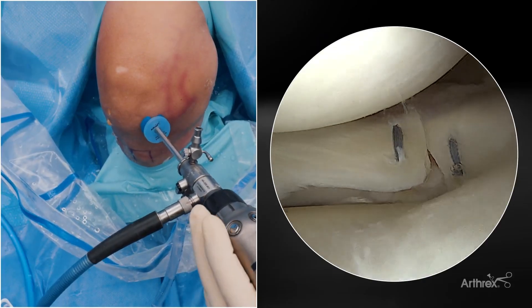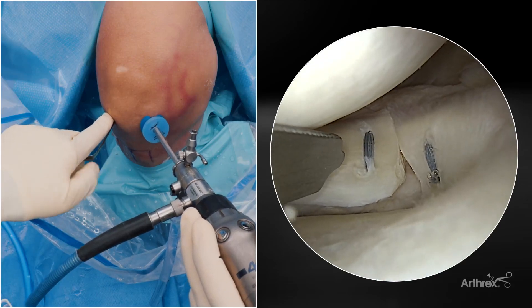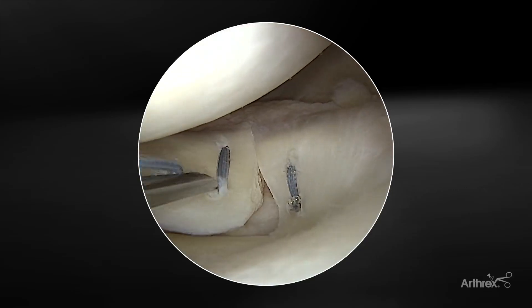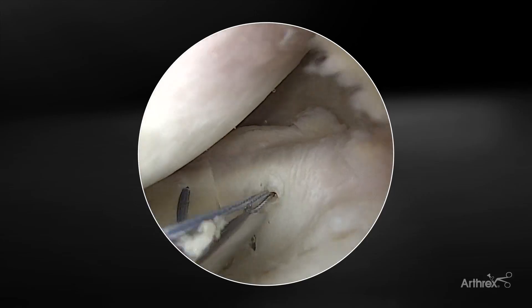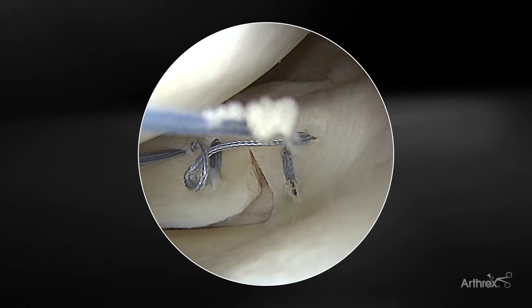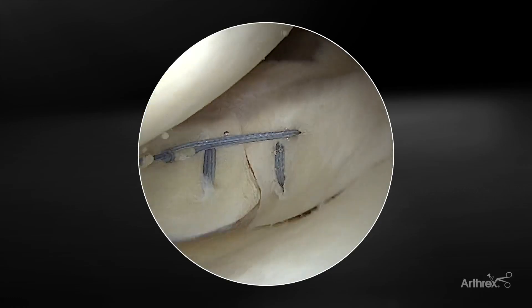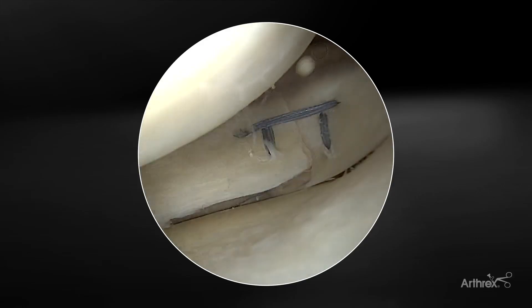Now we're going to introduce our first horizontal mattress stitch. It's always important to start peripherally first and then progress centrally. It's important for those ripstop sutures to be as close to the radial tear as possible, because sometimes you run out of real estate — particularly as you get closer to the root. We're utilizing the FiberStitch 1.5, and with the much smaller puncture holes we can get really complex configurations nicely. See that nice compression happening with the first compression loop? We'll use our knot pusher cutter to complete the tensioning, giving us nice compression across the peripheral portion.